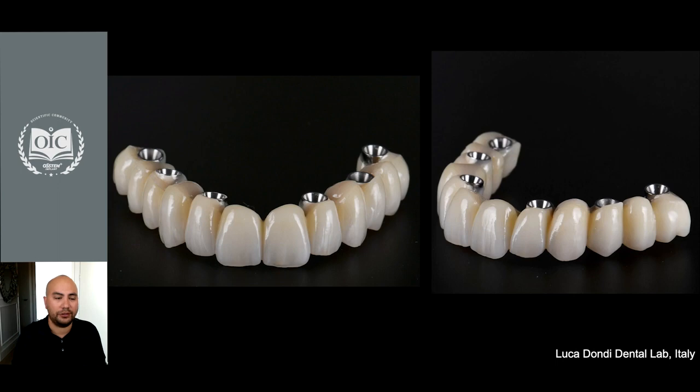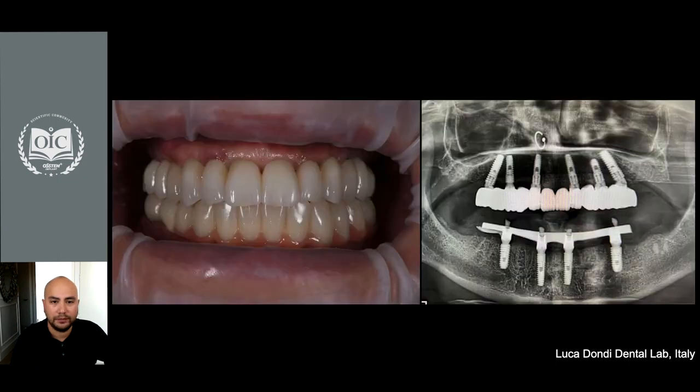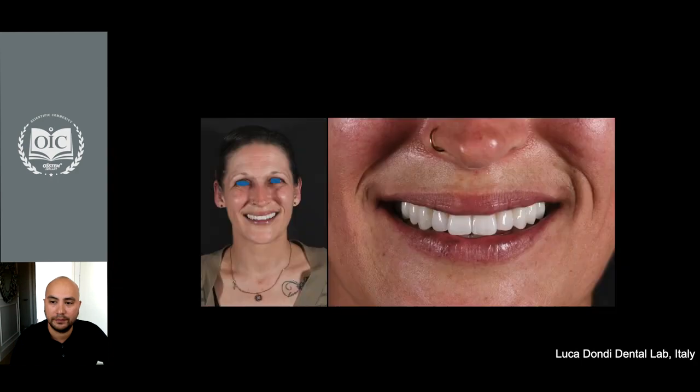And this is the final restoration done by Luca Dondi in Italy, and that's the final outcome with adequate fit shown on the post-operative X-ray.